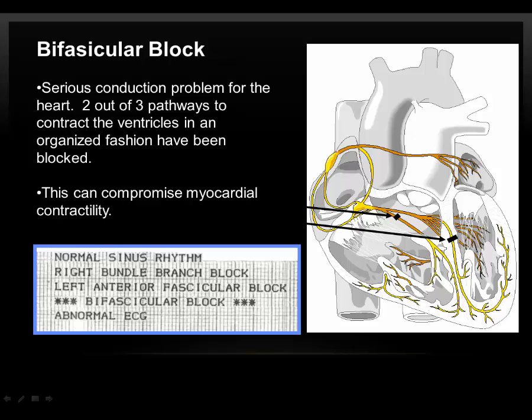Antiarrhythmic drugs are contraindicated in cases of PVCs or transient tachyarrhythmias, so treat the cause of the arrhythmia. In patients with signs and symptoms of an MI and all unstable patients, place quick combo or multifunction pads on the patient. Be prepared to pace the patient. Be prepared to defibrillate the patient. Some patients may tolerate this condition well until they get up to go do something. Their heart cannot fill the request for extra output due to the compromised conduction system.